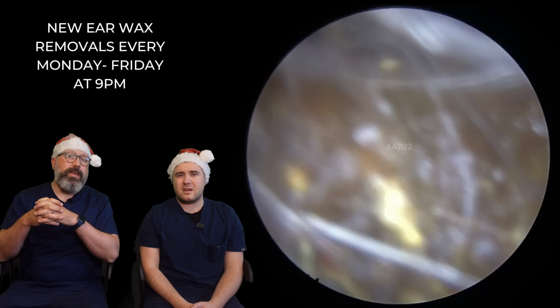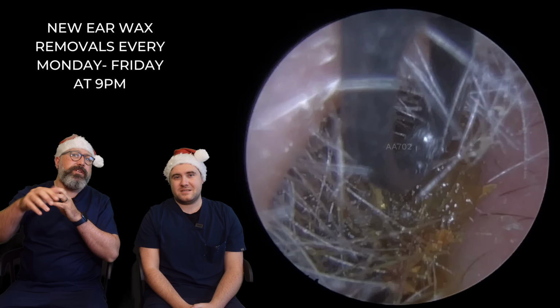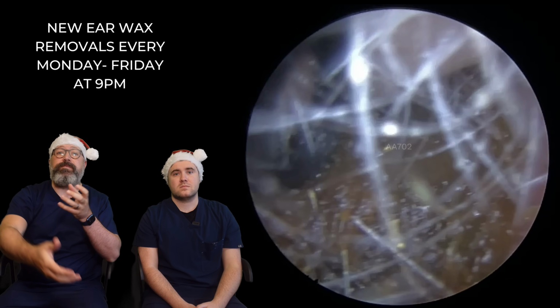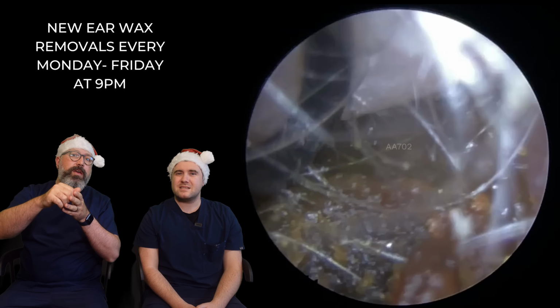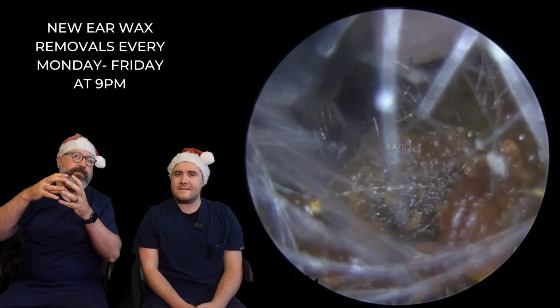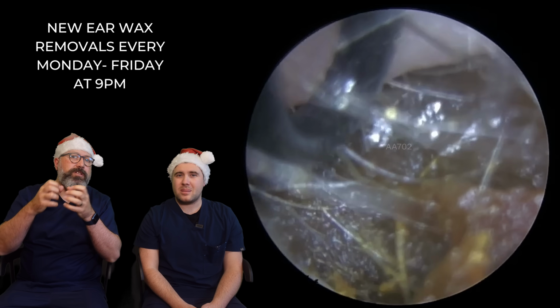This has really got stuck. This is putting up a fight. I think it's just an awkward shape. You can see the size of the ear canal there just by the end of the Jobson horn. Now obviously Jobson horn, great for this type where it's stuck on the outside edge. We can just get behind it and pull it through. But as we've got it out, we've sort of wedged it in that outer part of the ear canal. There's not a tremendous amount of room there, and it's quite thick and hard almost, this piece of wax.